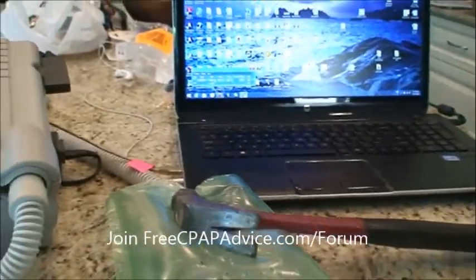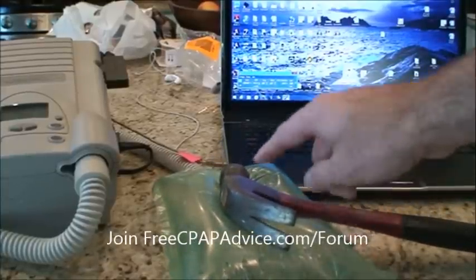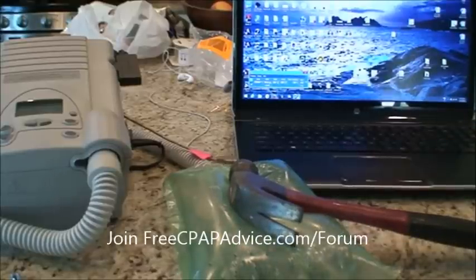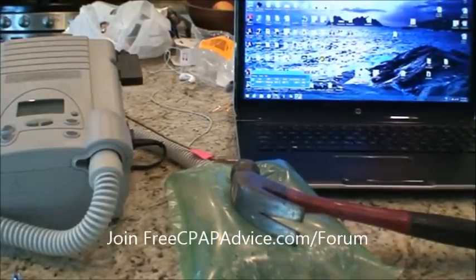So at some point you can even see visually that the hammer, our obstruction, is not able to keep the bag open like it had been. Before it was kind of like this, now it's sagging. And so some type of hypopnea or some type of RERAs may be able to persist. Now that's not exactly 100% accurate, but that kind of gives you the gist of it. At some point, the mouth leaking or the mask leaking is too much for the machine to keep up with. And so if you need to be at this pressure, because of the leak, you're only getting at this pressure. And so you need to do something about the mouth leak.